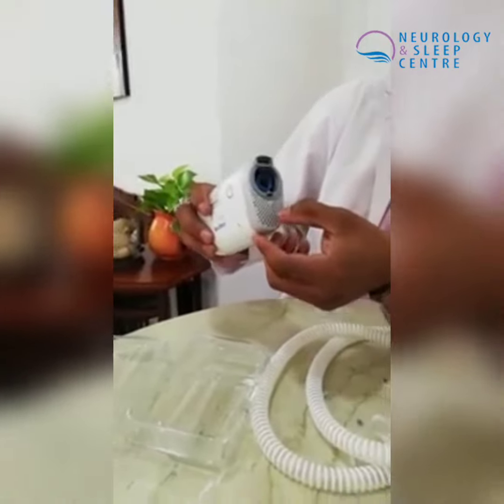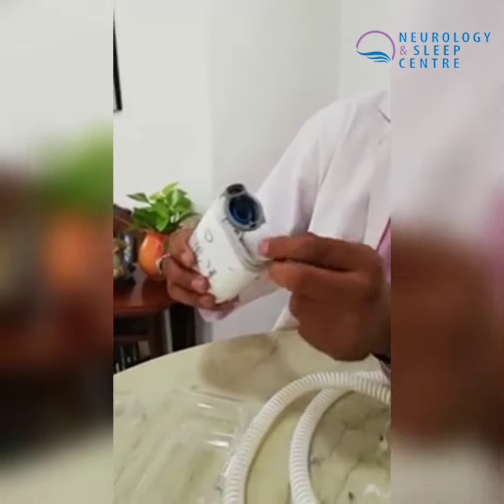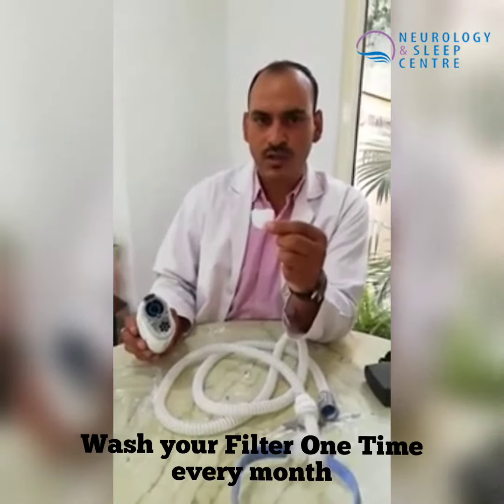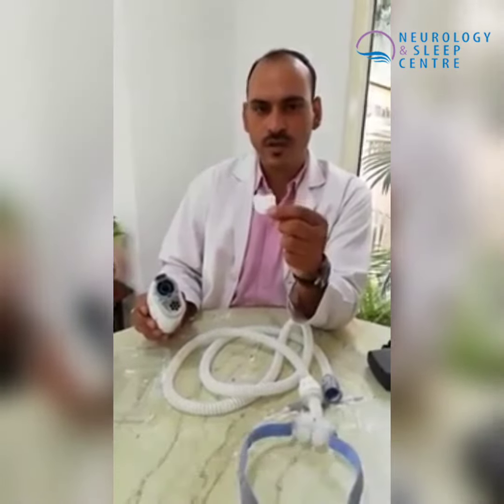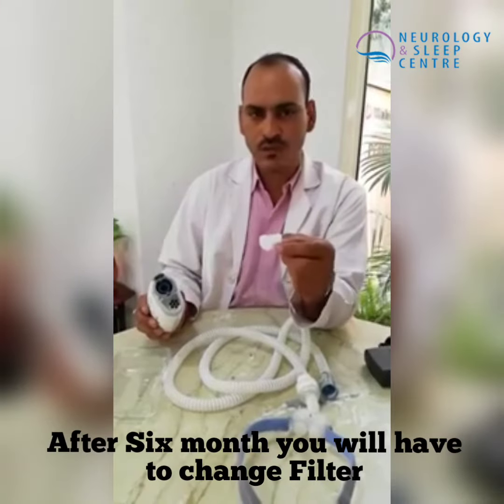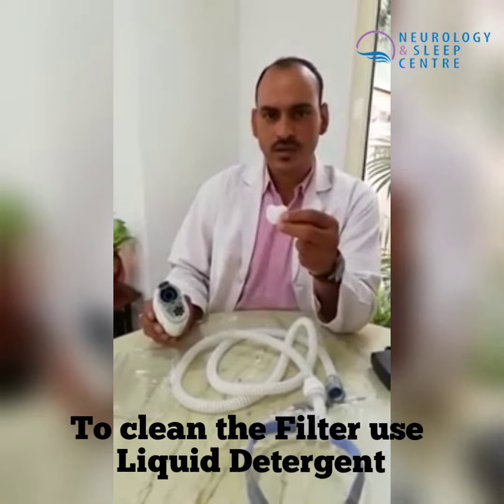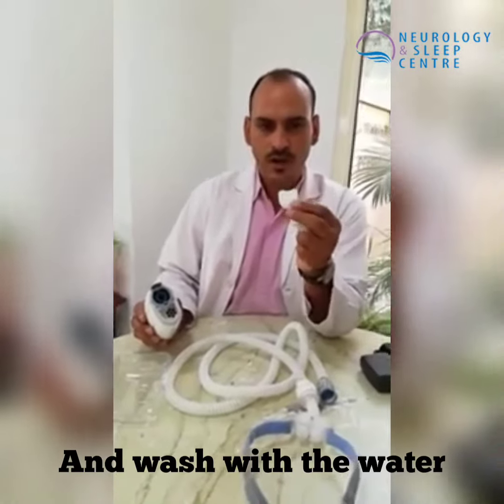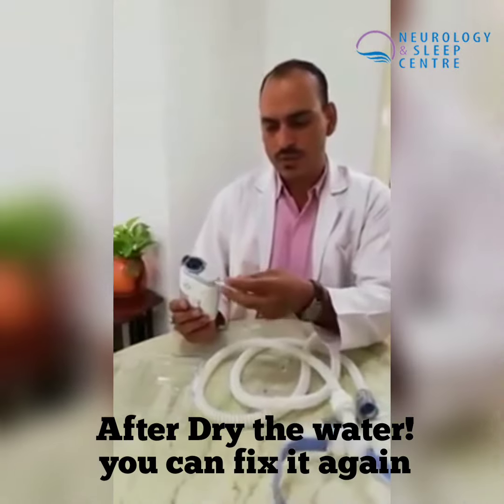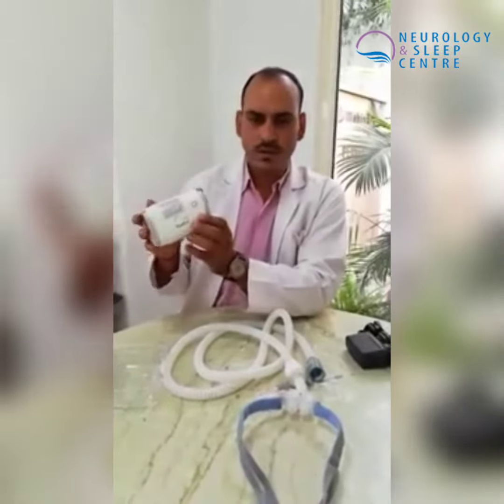How to clean the device: this is the filter. Every month we have to wash this filter. After 6 months, we have to replace it. To clean it, put liquid detergent in proper water, let it dry, then add it back to the filter and place it again.